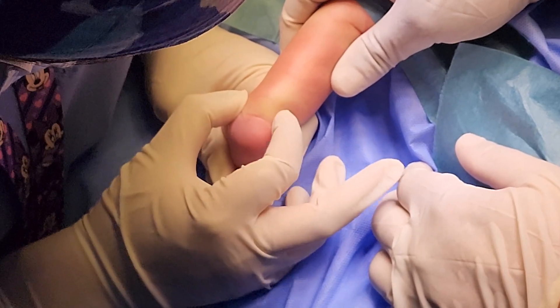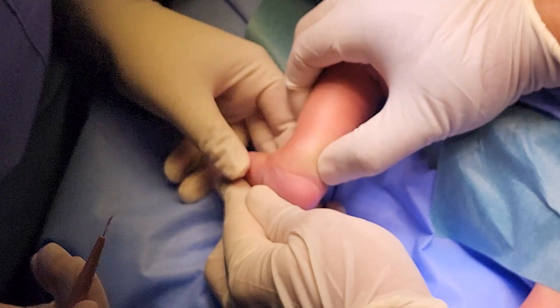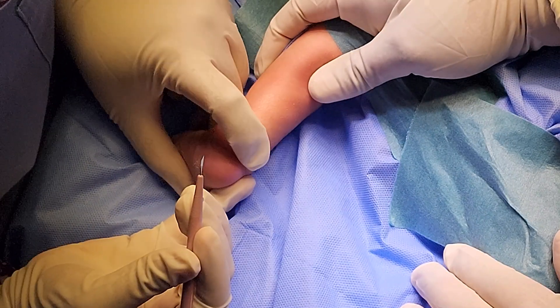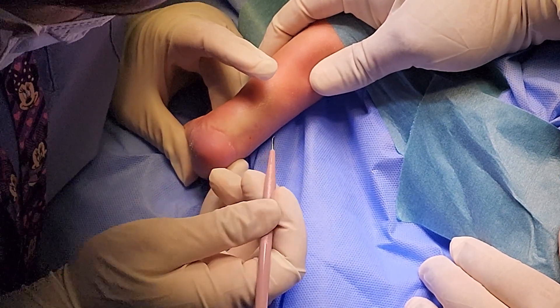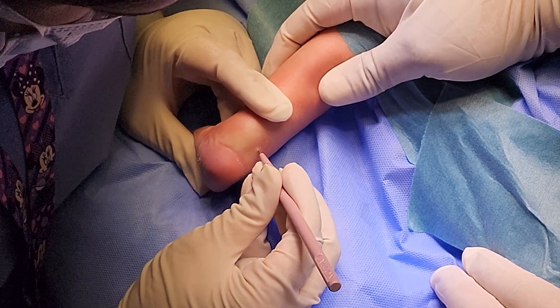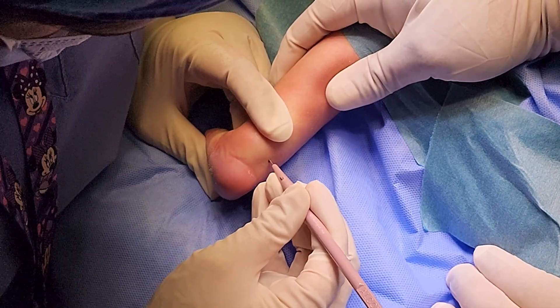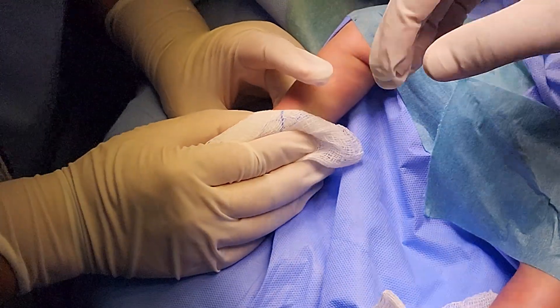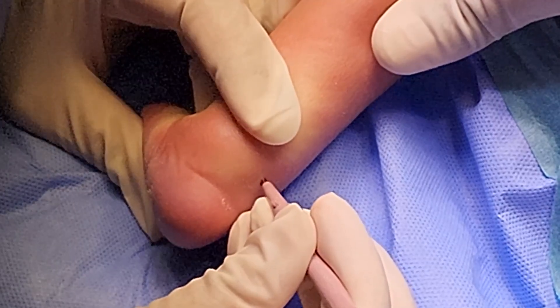Here my colleague is doing the procedure — she is feeling for the tendon and using the cataract knife to do the percutaneous tenotomy. The incision is usually higher, around 1cm above the crease, and sometimes you can see a dimple in the skin. You insert the knife vertically, then cut from medial to lateral, and you will feel a typical pop. It is easier to feel the pop than to see it.